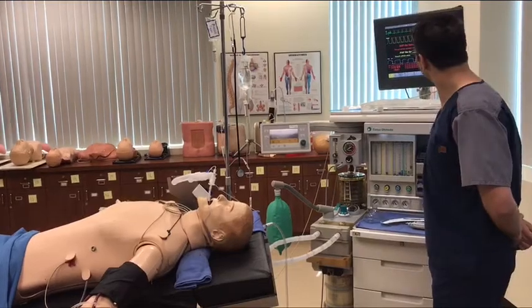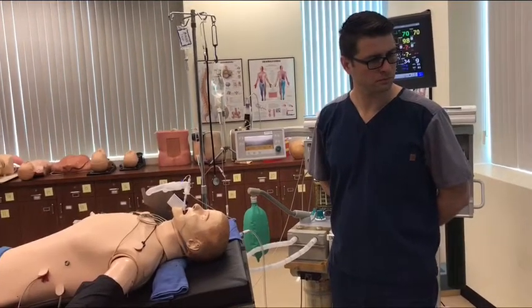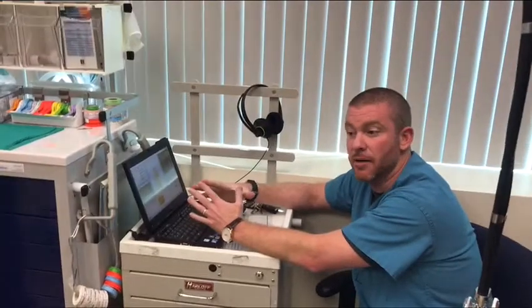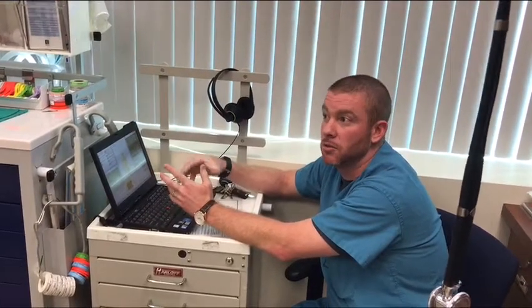You hear them, they start out at 5 or 6 millimeters of mercury. Okay, can we have high flow, please? When you're talking about flows like this, they're talking about the pressure of the gas that they're insufflating into the stomach. The stomach will start to distend. So it's going to be hard for my patient to breathe.